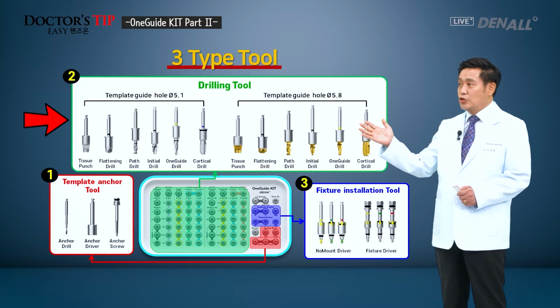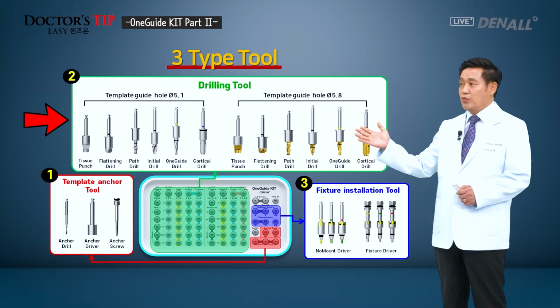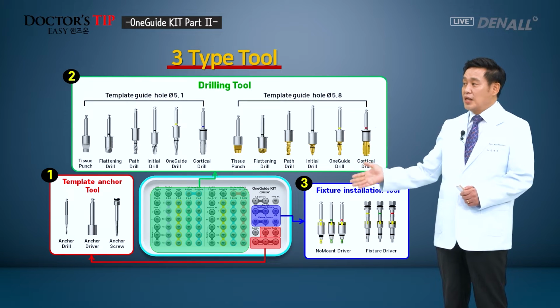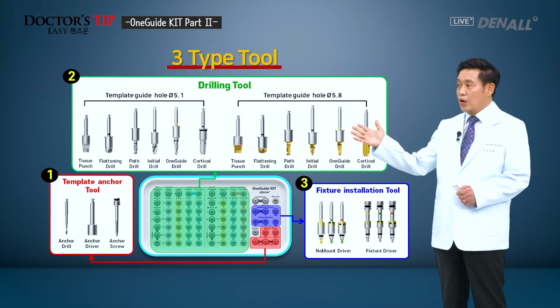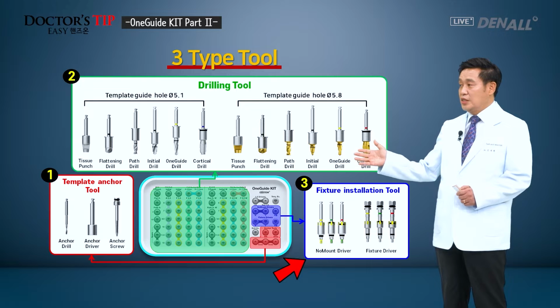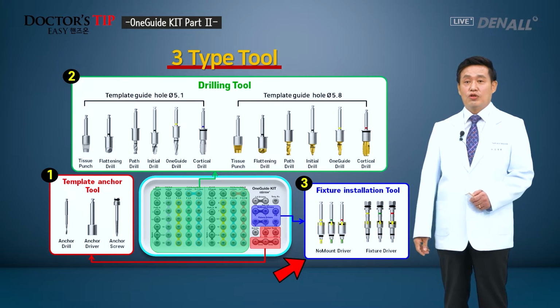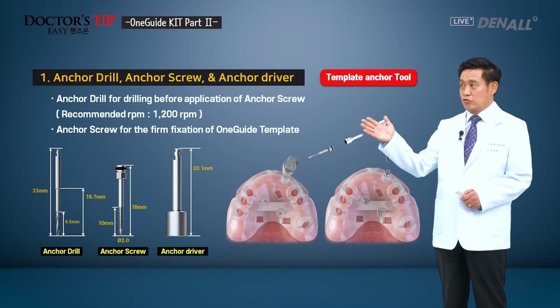Second is drilling tool. Basically, using OneGuide system, implant is being placed and drill is used for that end. Third, following the implant, template drill hole is created and fixture is placed, and this is a tool for that, and it consists of three tools. First is anchor drill, anchor screw, and anchor driver.